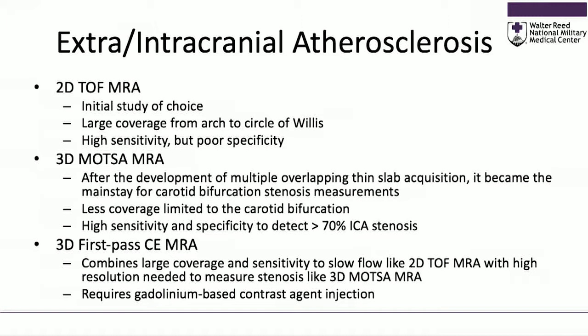2D time of flight initially started and was initially presented at these meetings as an excellent screening modality. We could get good coverage from the arch through the circle of Willis, and it was very sensitive to severe greater than 70% stenosis. But it wasn't very specific. Dennis Parker and others then developed and implemented multiple overlapping thin slab acquisition, or MOTSA, which became the mainstay both for cervical and intracranial MR angiography, and it still had the high sensitivity of 2D time of flight, but much more specificity. Its downfall was that relatively limited coverage, typically in the middle of the neck.